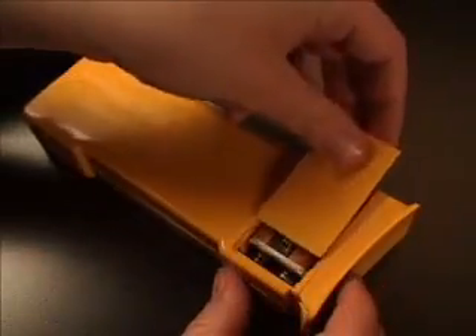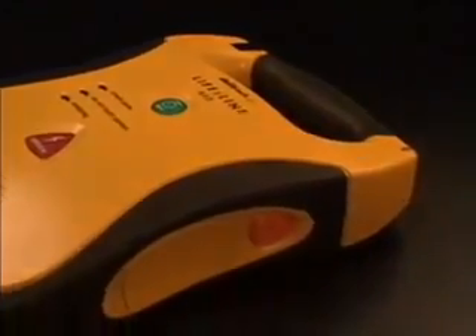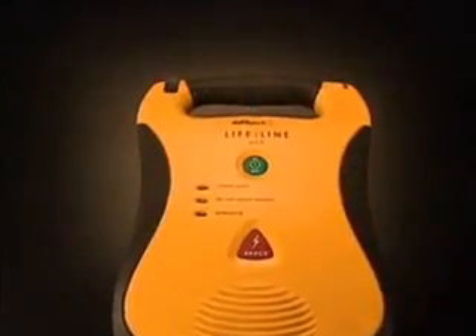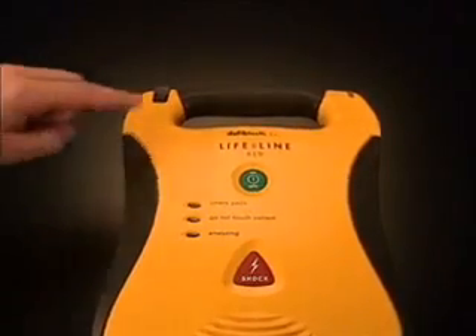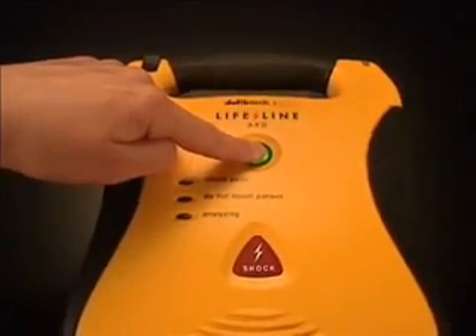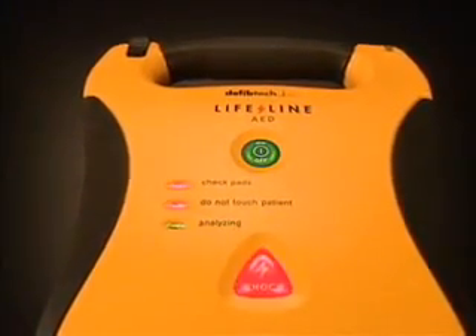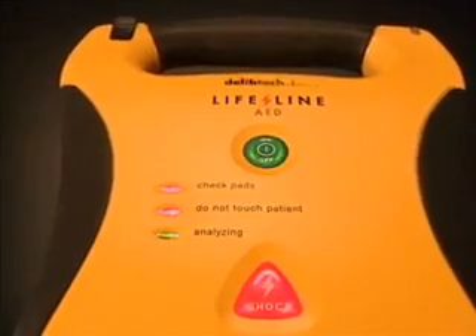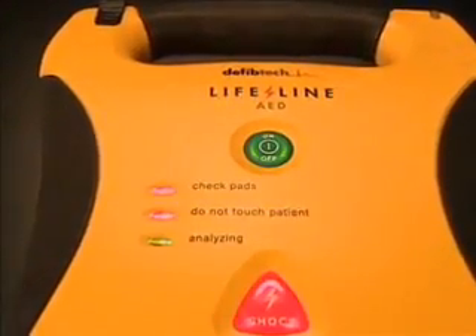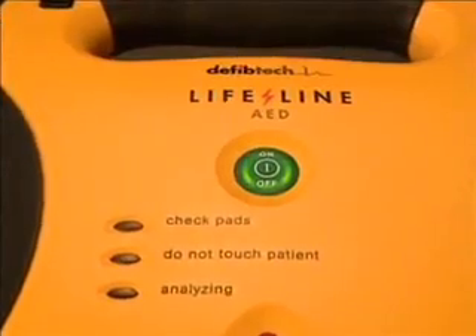When a 9-volt battery is installed in the battery pack, the AED will automatically run self-tests on a regular basis. However, there may be times when the user will want to run manually initiated self-tests. To run a manually initiated extended self-test, begin with the unit off and press and hold the on-off button for 5 seconds until the unit announces that it has entered the self-test mode. Performing unit self-test. The unit will run a complete extended self-test, report its status, and automatically turn off. Be aware that running a manual self-test uses one shock's worth of energy from the battery pack. Unit OK.